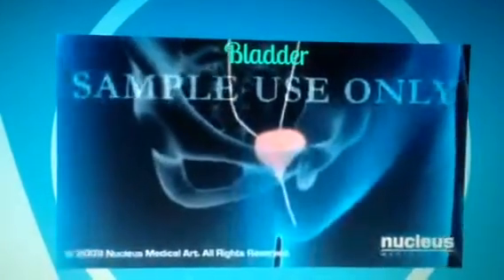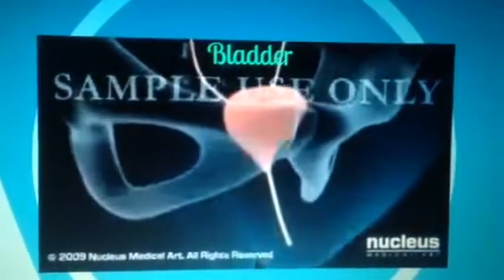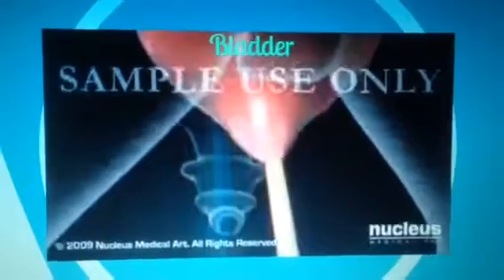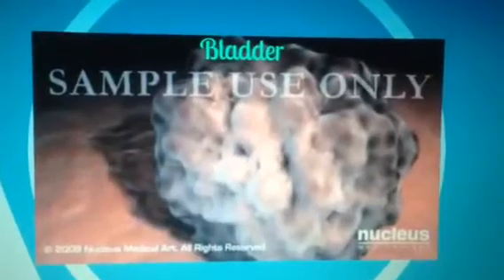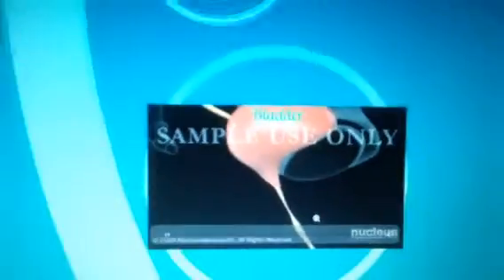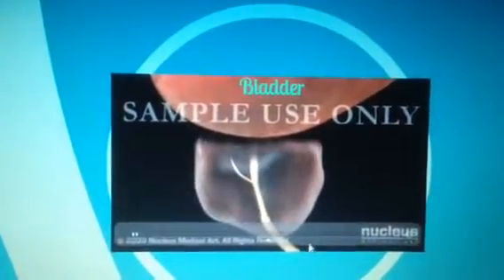By allowing your doctor to view the interior of the urethra, bladder, and the openings of the ureters, a cystoscopy may reveal the following conditions: an unusual growth such as a polyp, cyst, or tumor, a stone in or near the bladder, chronic inflammation or infection, a stricture or narrowing of the urethra, enlargement of the prostate gland, or ulcers in the bladder wall.